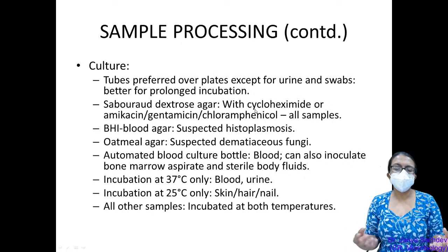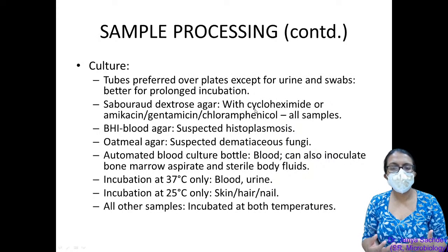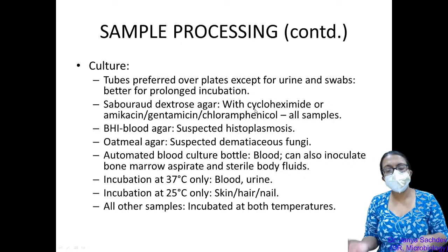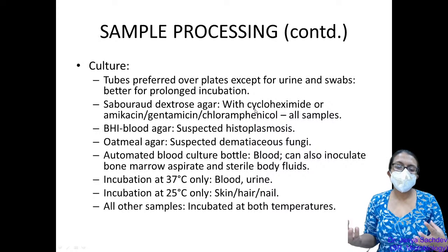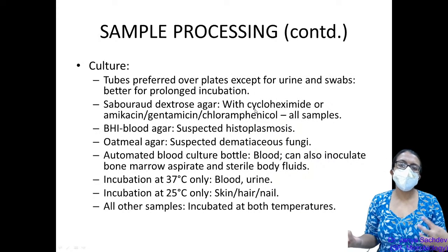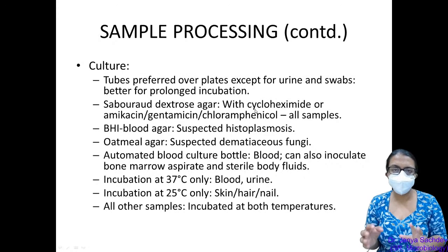So either way, caution should be exercised. Absence of fungal elements in direct microscopy can happen even if there is a fungal infection, if it's a low load or an early stage or a partially treated infection. Positives in culture without a microscopic positive may indicate sample contamination rather than an actual pathogen. So in either case, caution should be exercised while interpreting the results.